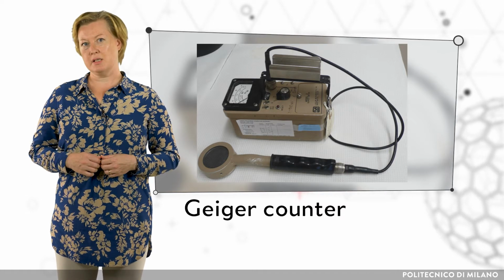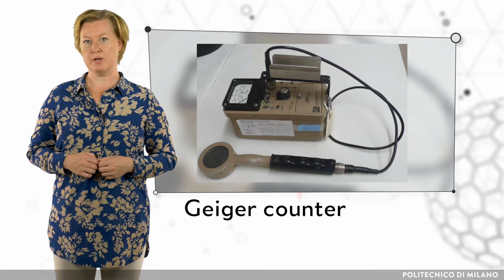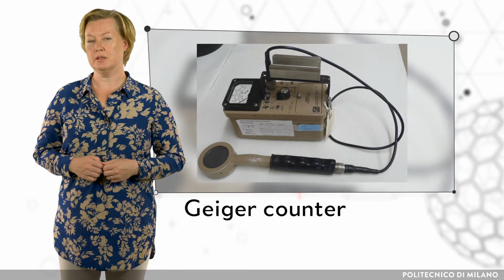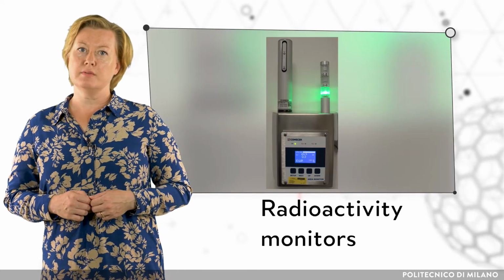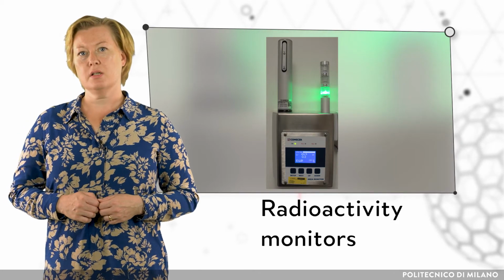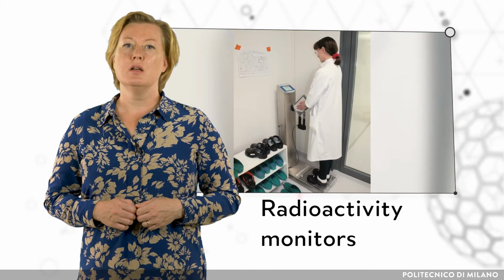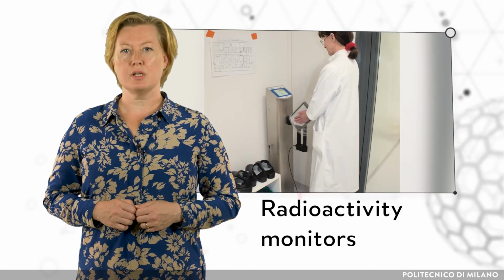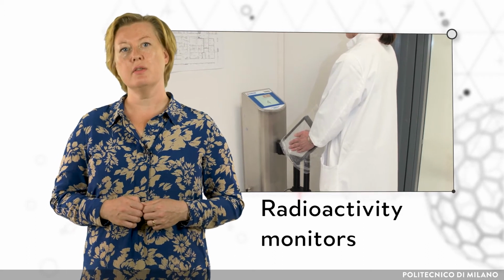It is kept in the general vicinity of their workplace to monitor activity levels in unshielded regions. Stationary area radioactivity monitors are present in common areas to warn of high levels of activity. Monitors are also placed outside of the radioactive facility to scan personnel leaving the facility.